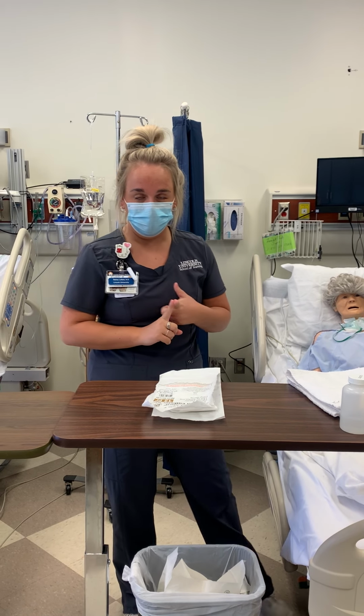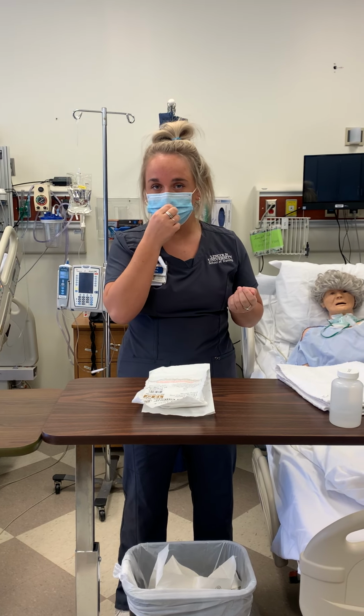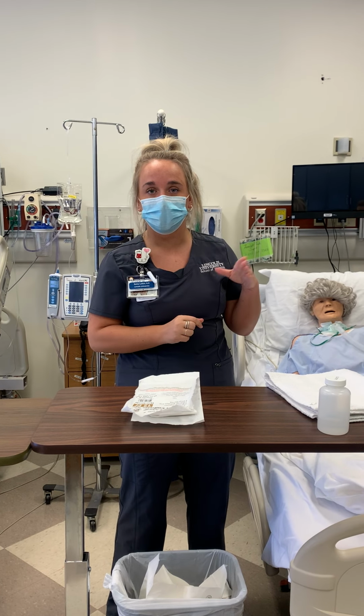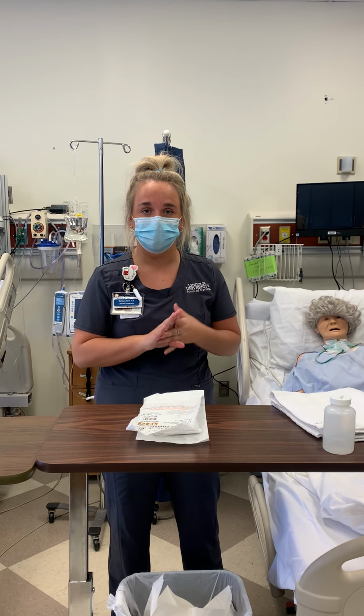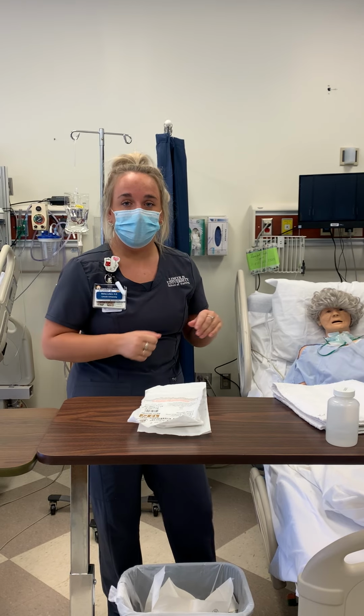Before I entered the room, I would want to check for a position order, and then I'd want to indicate whether my patient needed suctioning or not by listening to her respiratories, seeing if she has any increased secretions, if she's coughing a lot or having trouble breathing. Also want to give her a listen and look at her O2 stats as well. Then I'd gather all my supplies and then go ahead and head into the room.